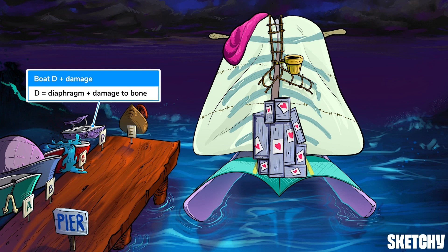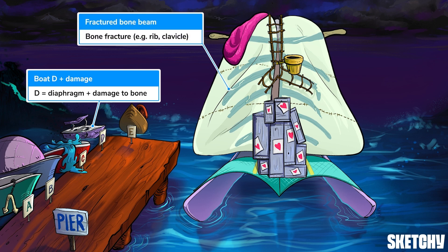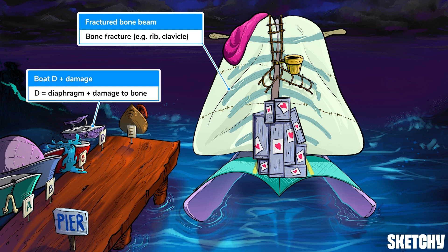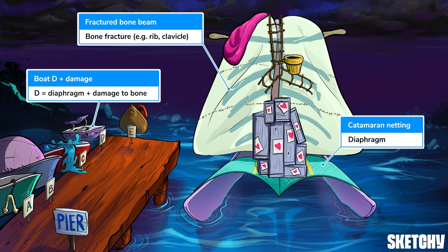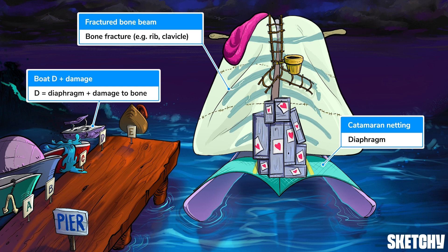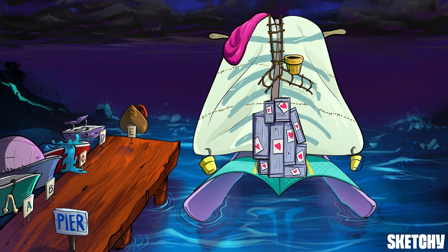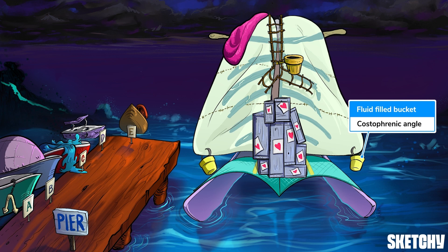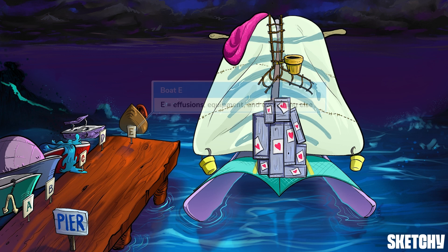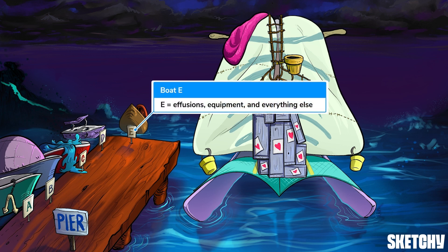We might not have capsized, but it's still important to survey the damage. Boat D appears to have taken the storm's biggest brunt, and the crossbeams might need a little repair — a reminder to check for bony pathology like rib and clavicle fractures. The hulls are intact, and stretched between them is catamaran netting, our recurring symbol for the diaphragm. Inspect the dome-shaped hemidiaphragms, which should appear sharp and well-defined. Gino's hung these buckets to symbolize the approximate location of the costophrenic angles, the angle where the diaphragm and thoracic wall meet. In upright patients, fluid can collect here, resulting in a pleural effusion.